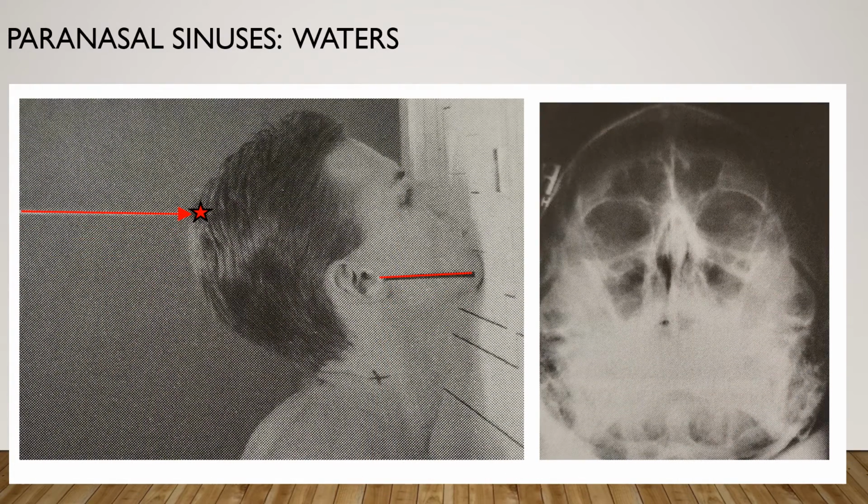The third X-ray you're going to take is going to be a Waters, also called a parietoacanthial. This is that 37-degree Waters we talked about a few moments ago. The chin is going to be extended and touching the imaging device. Adjust the head height of the IR to center at the acanthion. Once again, remember the acanthion is going to be below the nose.